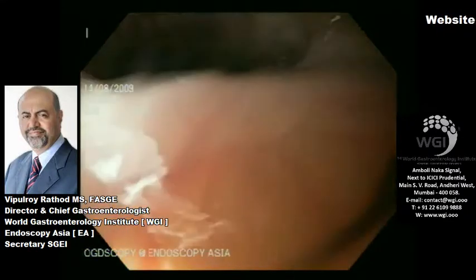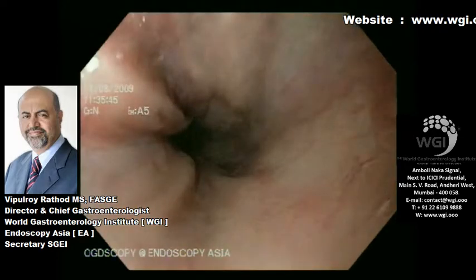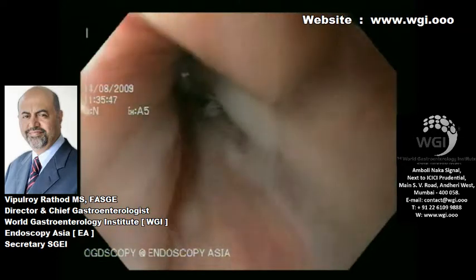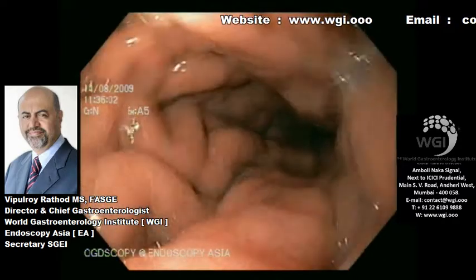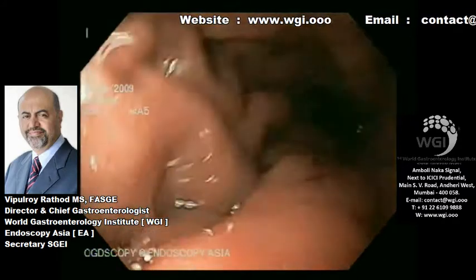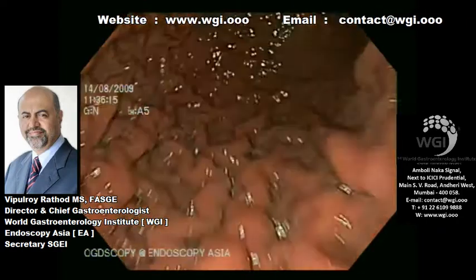This is a 51-year-old chap who presented with one episode of melena, for which he had a gastroscopy. His background history includes gastric varices five years ago which were glued, and he was then lost to follow-up. He is a known case of liver disease secondary to alcohol, Child-Pugh grading B.